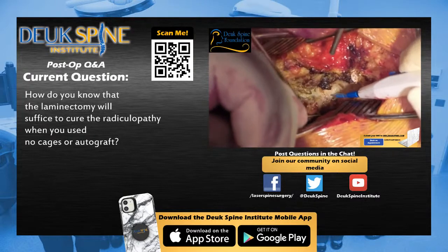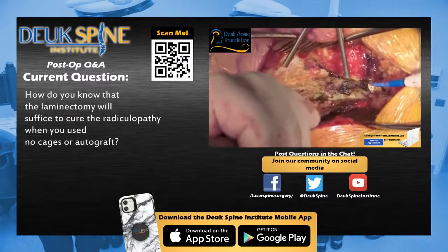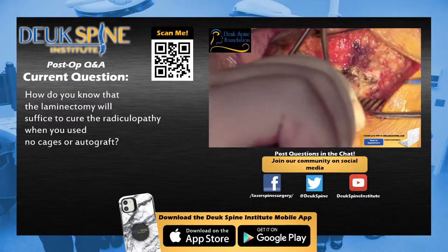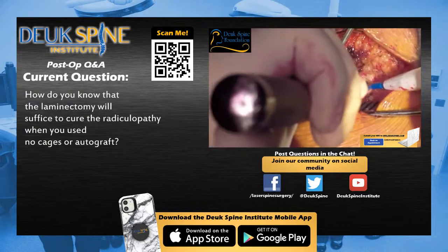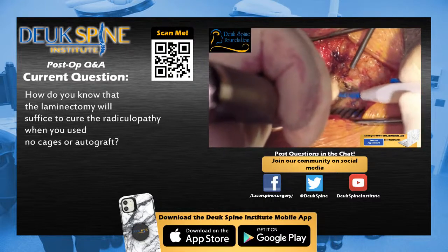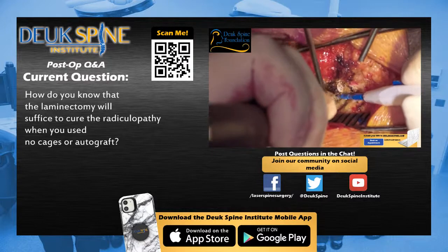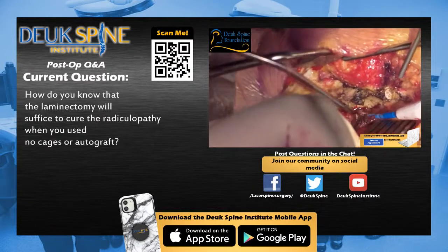So I used the drill to decorticate the bone, basically remove the bone surface to promote fusion. And then I packed the stuff in the gutters on both sides, and that was actually a mixture of allograft and autograft together. So we did use autograft, but the graft material itself doesn't unpinch the nerves. It just promotes fusion.